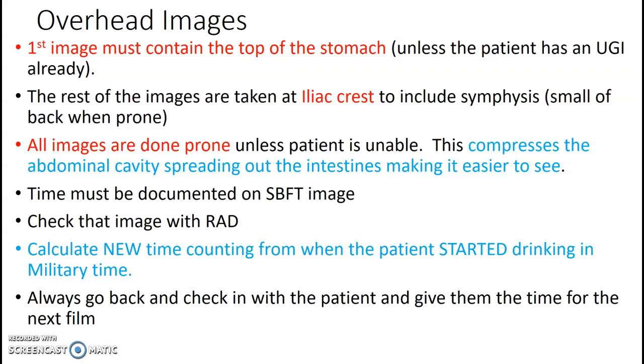And then you're going to check that image with a radiologist. They're going to say, do another film in another 30 minutes. On your little card, you're going to add the time together from the start. So that's going to be a 1-hour film at 08:30, if you're with me, all right?